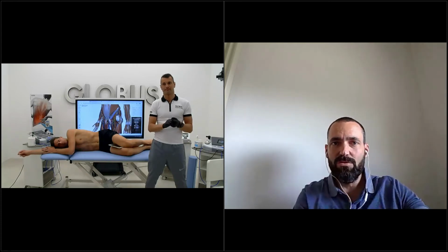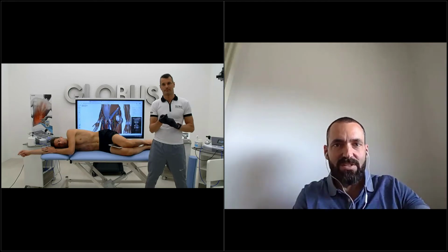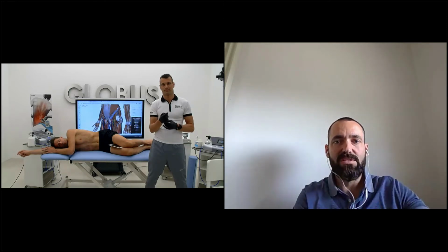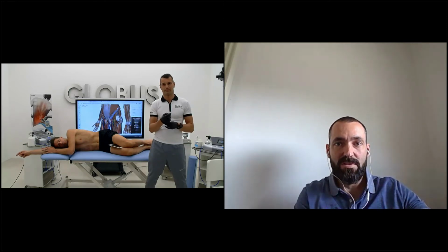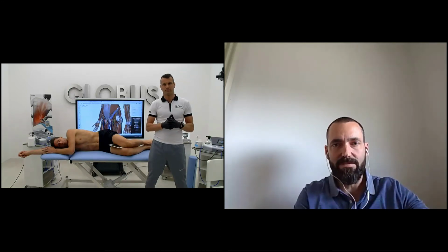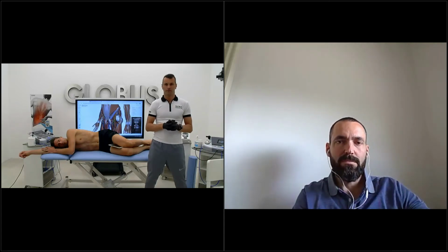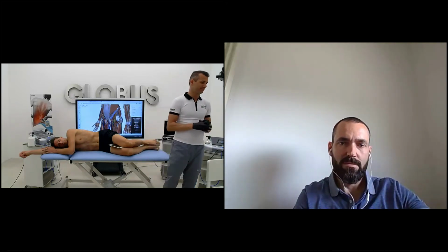It's possible to do it the day after. It's possible to do it every 2 days, every 3 days, or once a week. Sometimes that is enough. In my opinion, if you treat myofascia, for example chronic plantar fasciitis, once a week can be enough. Good answer. Thank you.